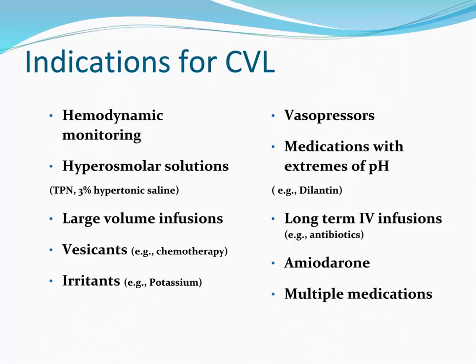Also, be aware that the waveform on PICC lines can be dampened, making the number less accurate. You can offset some of this by following the PICC line flushing guidelines carefully to optimize the waveform and integrity of your numbers. So, do your square wave test first to determine whether your waveform is acceptable, and zero your transducer before obtaining the CVP reading.